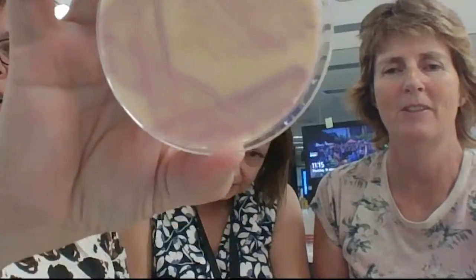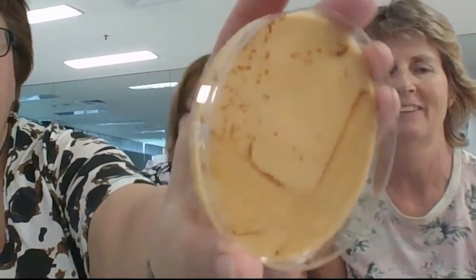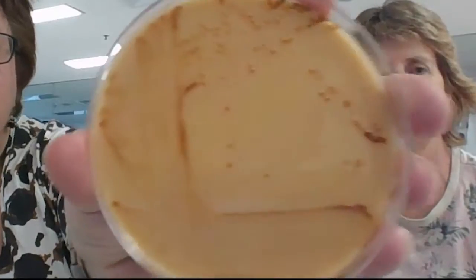So they would have looked identical on that horse blood before. Yes. Here's a staph, sort of like a light pink. And this is a particular staph that likes to cause urine infections. And here we have Proteus. I'll just put it up there, a brown colour. Amazing. So these chromogenic agars are such an advance.